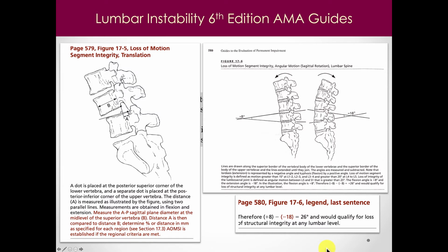So with that being said, that's how the angulation is different on the lumbar spine. So you can see they're not consistent with how they do angles from the cervical spine to the lumbar spine. But again, it's the guides, right? So my inside baseball commentary, I just do this to be colorful, so it makes you think.